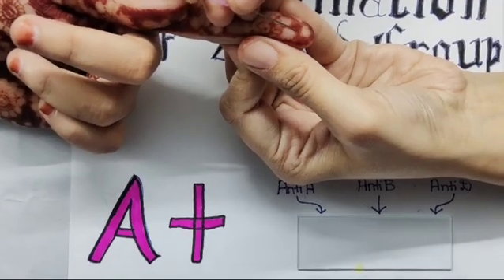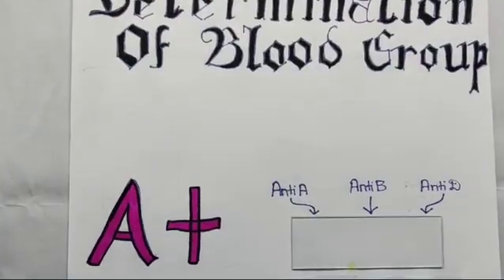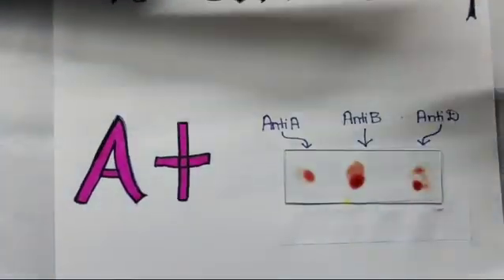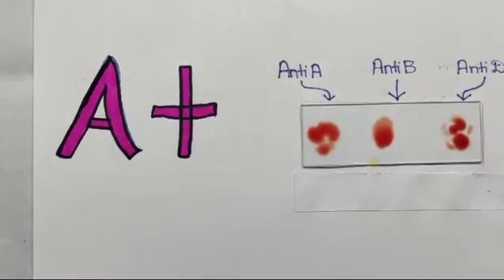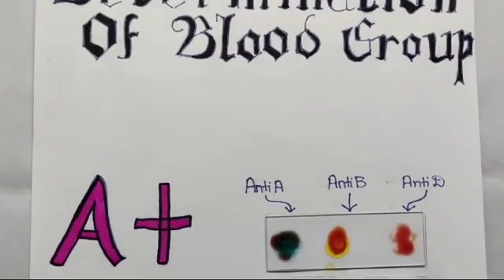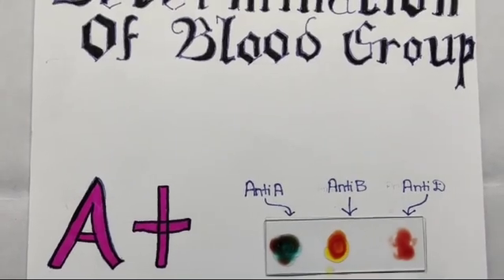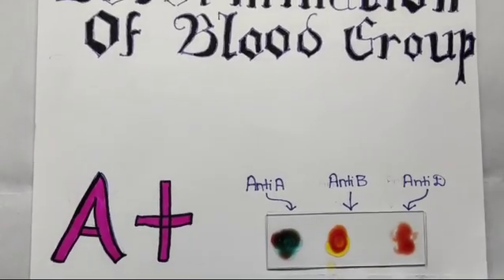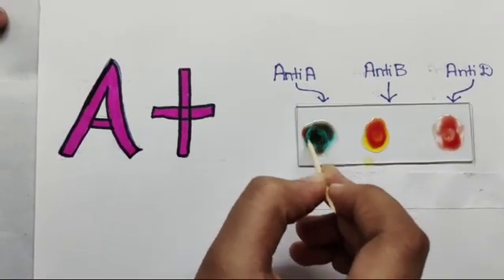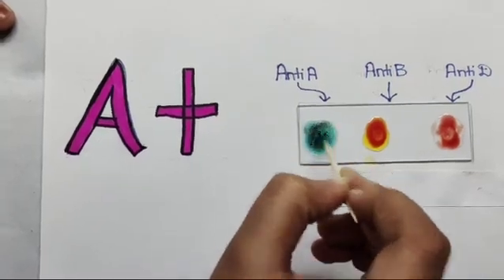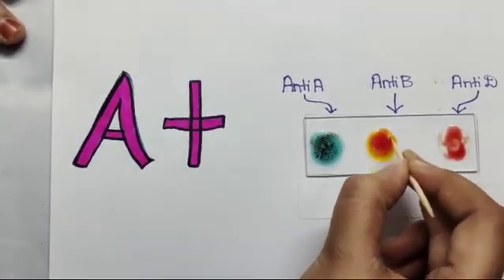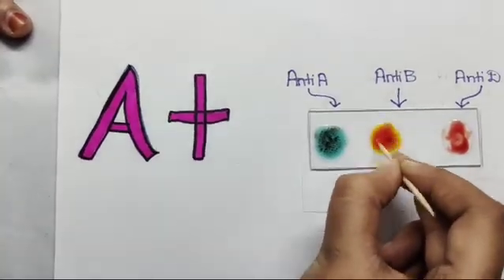Let's see how to determine A positive blood group. Follow the same procedure and check whether clotting has occurred or not. Clotting is seen only in anti-A and not in anti-B. That means antigen A is present and antigen B is absent. Hence, it is A blood group.